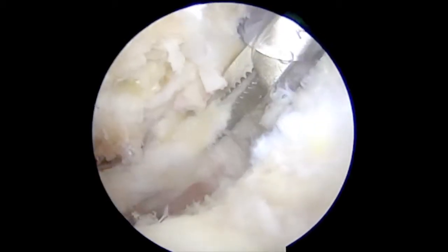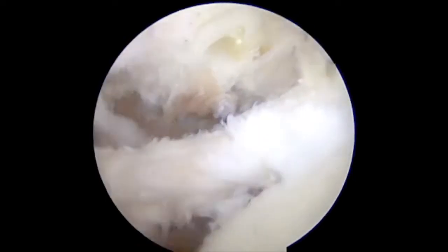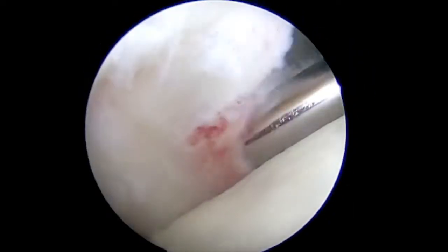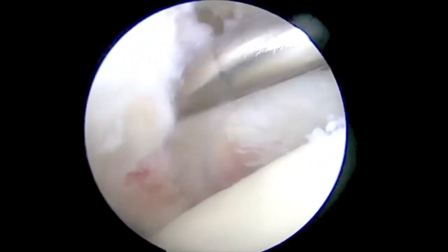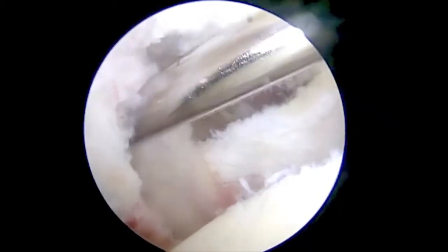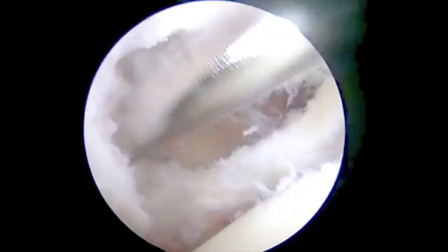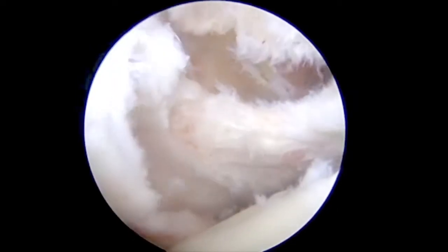Sometimes these tears are quite retracted and scarred, so performing an appropriate and safe release is optimal. Adhesions are released using an arthroscopic shaver along the subscapularis to gain excursion. A radiofrequency wand can also be used. The surgeon should take special care, as innervation is supplied from the superior aspect of the muscle.